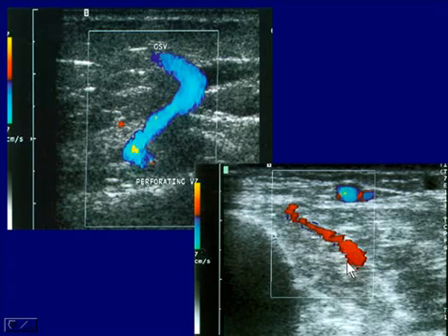We have to be careful because the perforating veins do have a small companion artery, and you can see that flashing at times, and it might confuse you. But again, the veins usually have lower flow states and a more continuous color appearance to them.